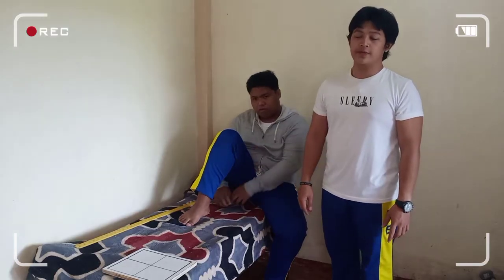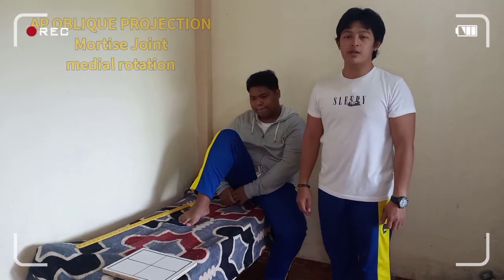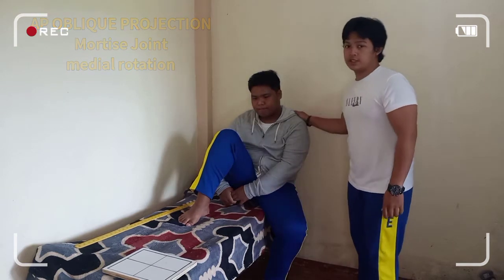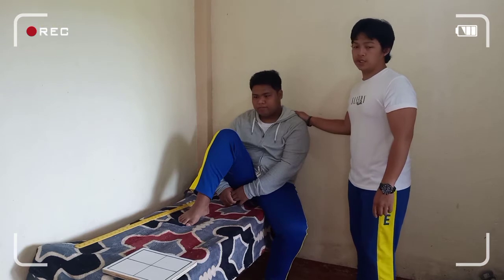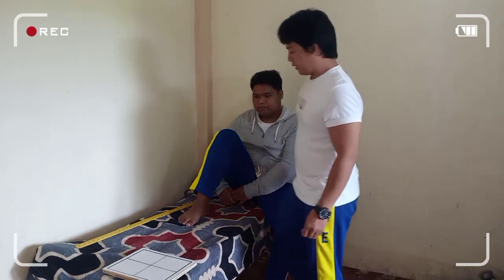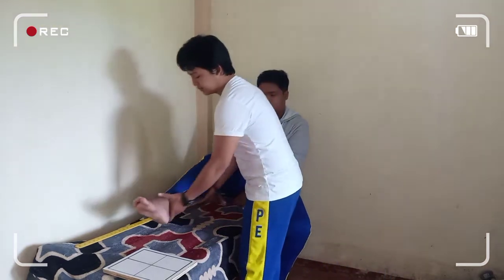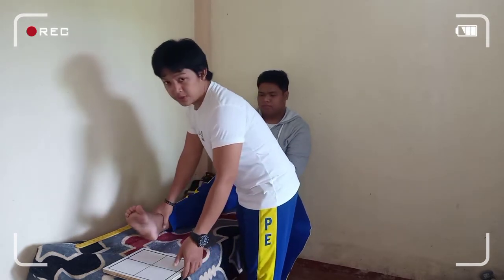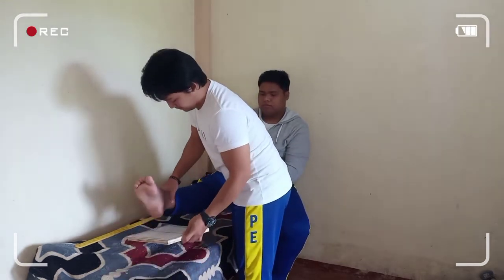The second projection of the ankle is the AP oblique mortise joint, medial rotation. Have the patient seated or in supine position on the radiographic table and extend the knee. Place the image receptor to the ankle joint.